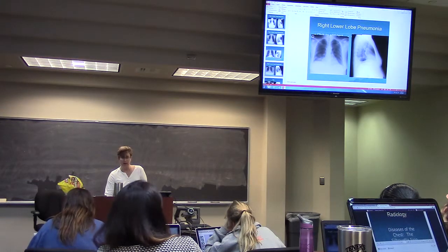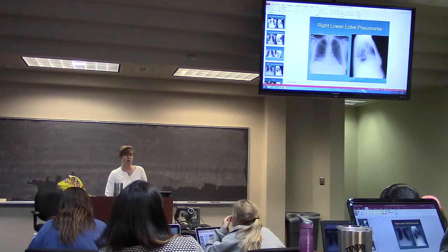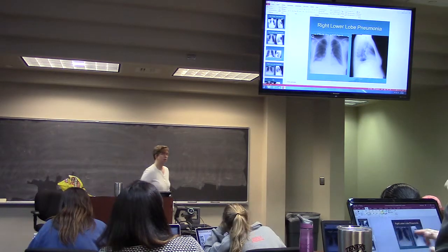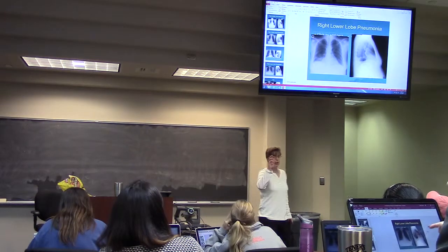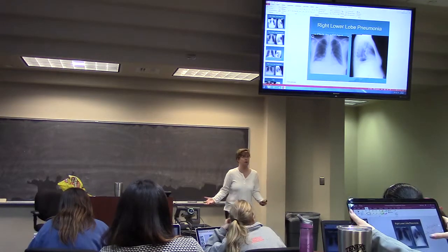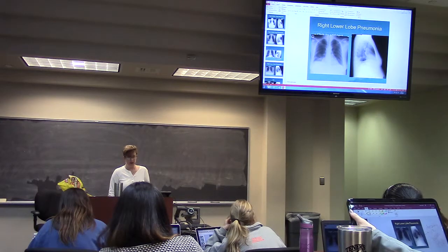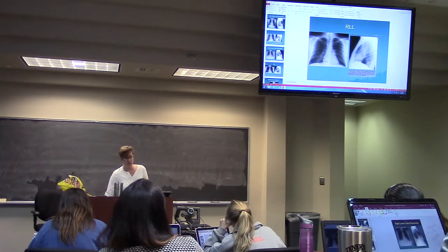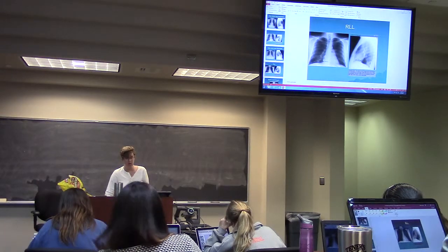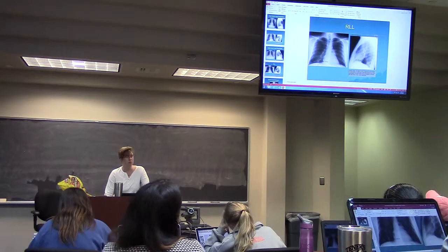Here is the density right here. That's in my right lower lobe. So the vertebral body should get blacker, blacker, blacker, blacker as you go down. And there's something white sitting right there. Here's some streaking that's coming down. A little bit of loss right here, a little bit.